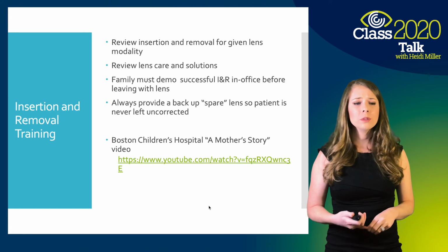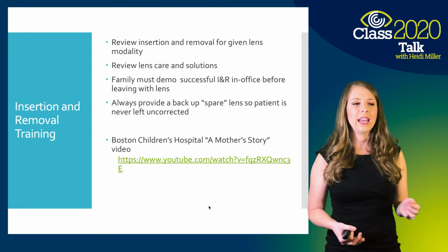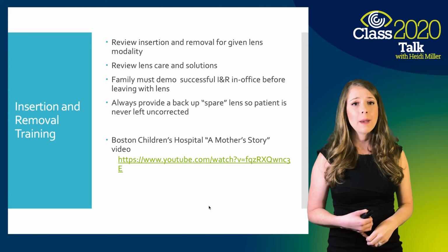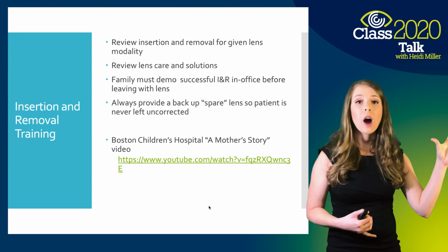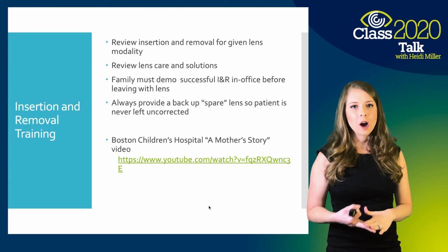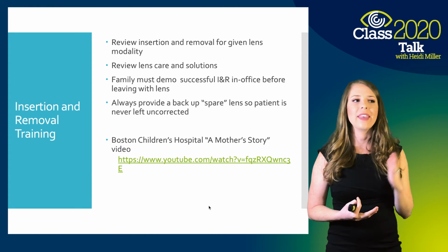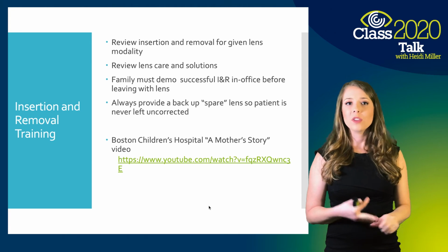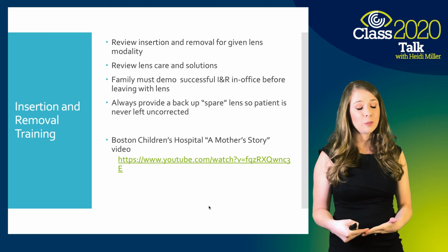So make sure you're reviewing those lens care and solutions at all your follow-ups. It just takes a brief moment, and it's nice to reinforce that each time they come in, just to make sure, like I said, that they didn't pick up habits, they didn't run out of something and then think that they could just use a saline wash as a cleaner. And then also making sure that they're never using water. I don't know how many times I tell patients that, even adult patients, over and over about the water, and then they come back and that's the one thing they forgot, that they couldn't use tap water. And so the more you repeat yourself, the more you reinforce, the more likely they're going to follow and be compliant with the care that you're prescribing.